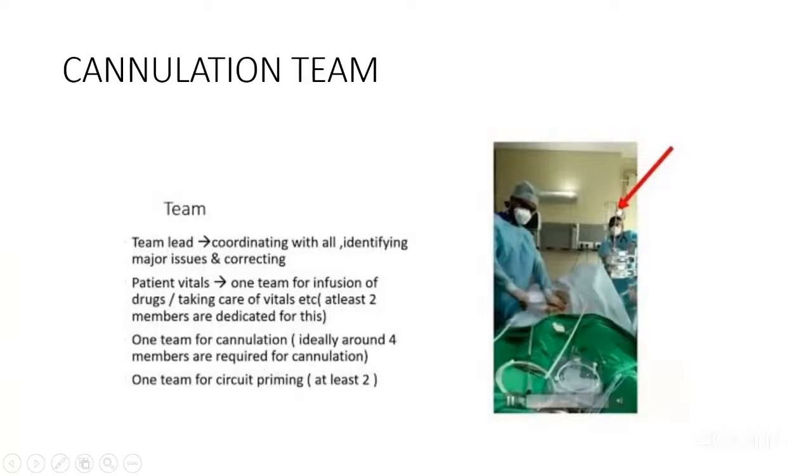The circuit priming will be done when you start cleaning and draping for the patient. The circuit priming will be started, so by the time your whole assembly is ready, the circuit priming will also be ready, and you can use it while you connect the cannulas to the circuit.